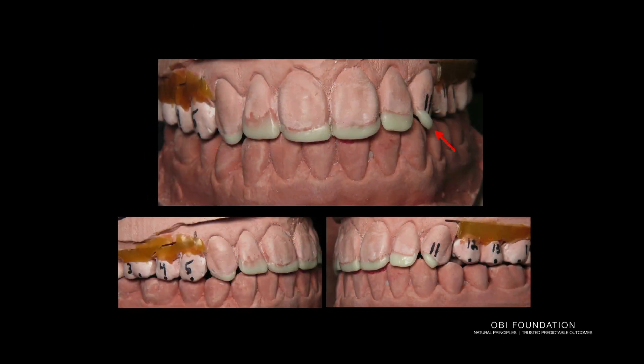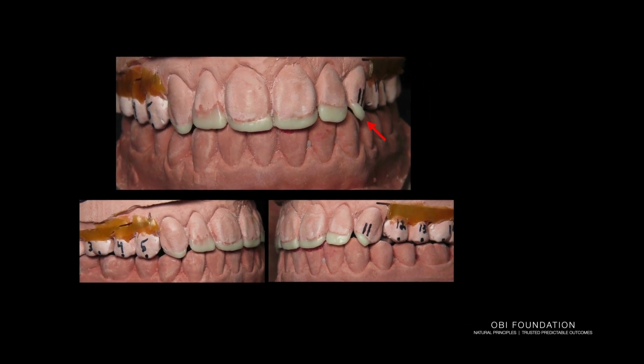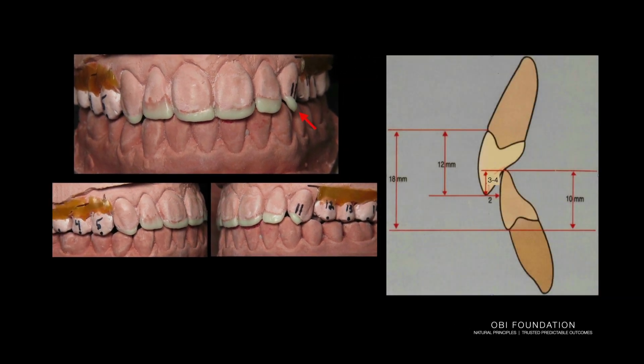We do our wax-up, and this is so critical: we need to apply these principles and we need at least three — hopefully four — millimeters of overbite and one and a half to two millimeters of overjet for proper anterior guidance and function. You can see I've projected that cusp tip on number 11 because that's where ultimately that tooth has to be placed orthodontically in order to restore it properly.